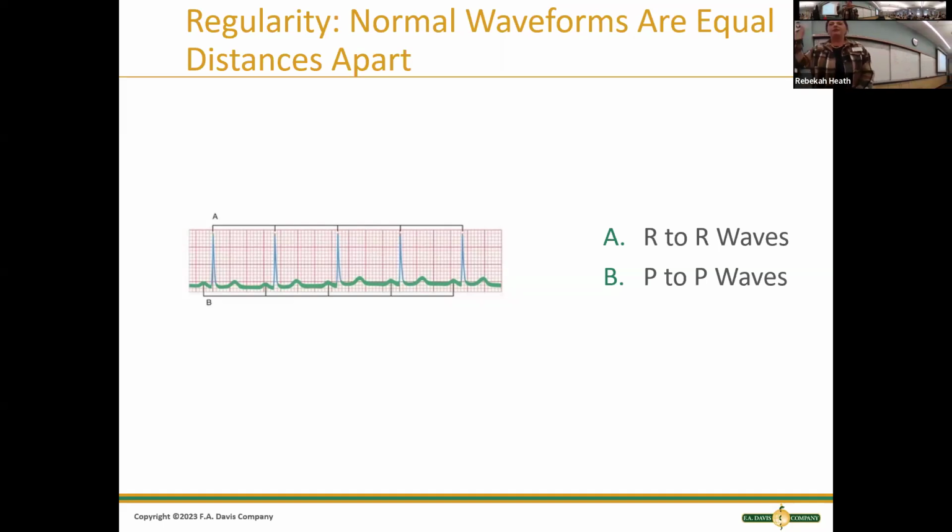I like to just get a piece of paper. That's why I gave you guys just blank sheets of paper. So what you can do is get your paper. I know mine's not long enough, right? This is a really bad EKG, you guys. But essentially, you're going to line up whatever you're trying to measure, and we're going to try to measure regularity.